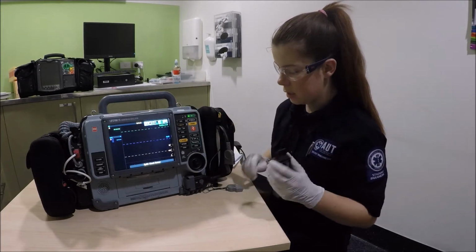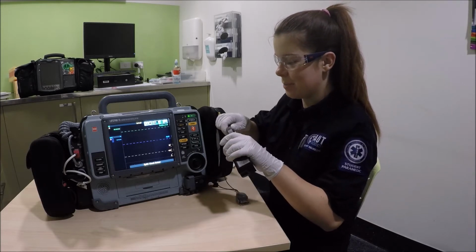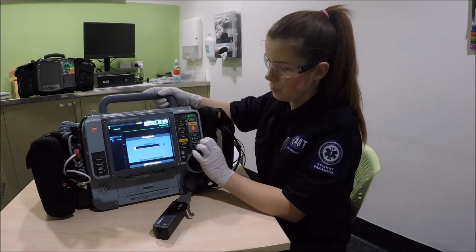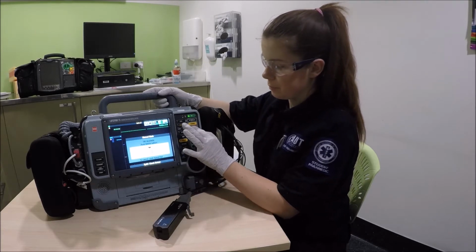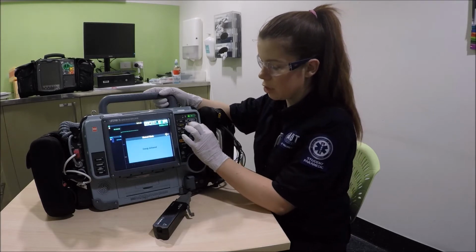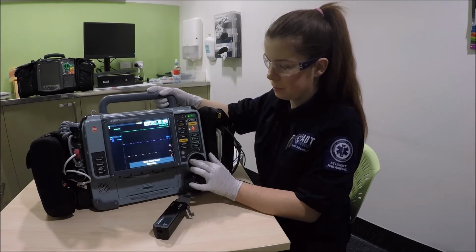So we're going to connect our test charge now. The lead is always connected to the AD pads in case it has to be used. We're going to arm a charge. We do have to be careful because it is live energy being used. So that's delivered. We're going to arm a second charge, but then I'll disarm it by pressing the speed dial here.